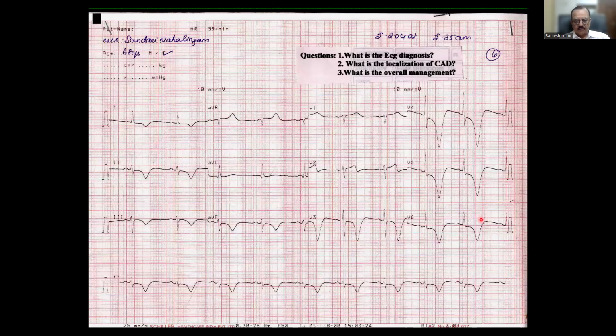Concentrate on the T wave now. Do you think this T wave is normal or abnormal? See this T wave, this is the T wave, this is the T wave. Is this T wave normal or abnormal? Abnormal. What is the abnormality? Opposite direction. It is opposite to the direction of the QRS, the R wave. Correct. Very good. So it is a disease. We will see what it is subsequently, in the next two classes.